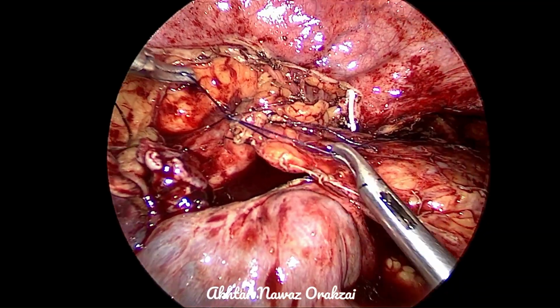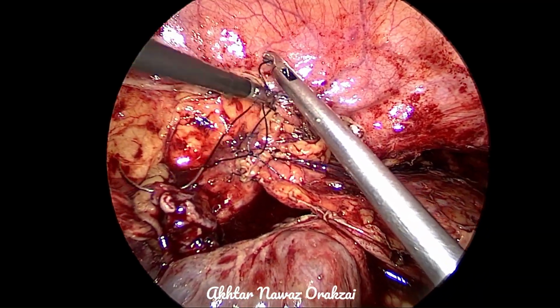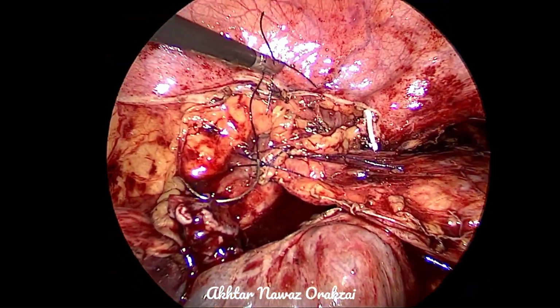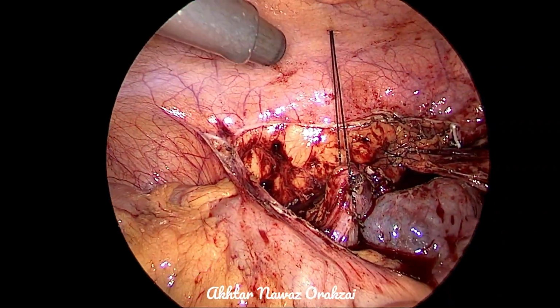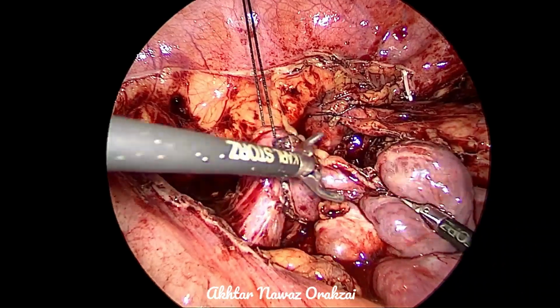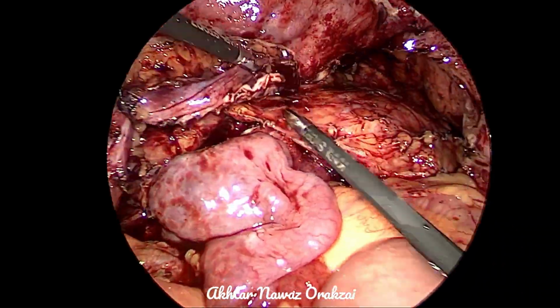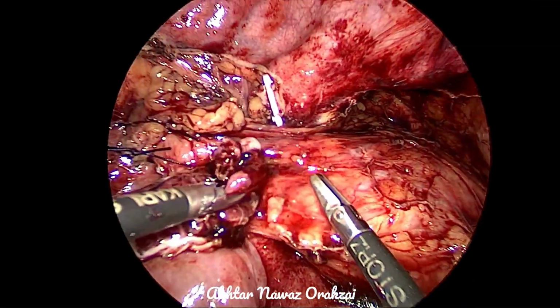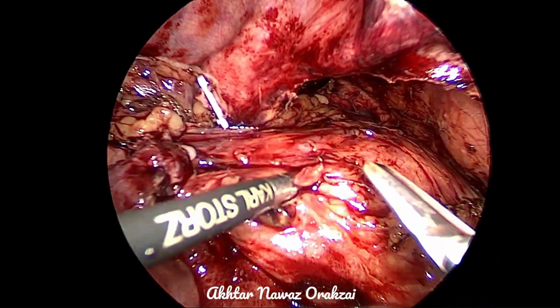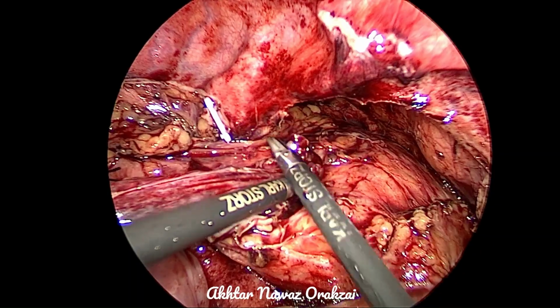As I also mentioned in the previous video in VVF repair, it is important to take out the needle under vision and cut all those extra sutures, because the sutures will be coming into our way again and again, confusing us. So now we decide where to place our ureter and its anastomosis.